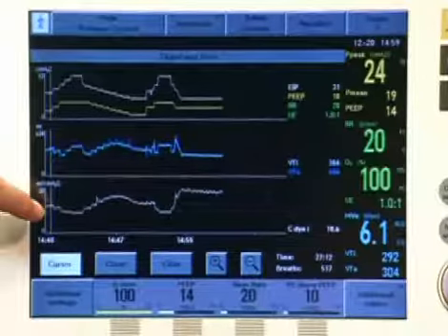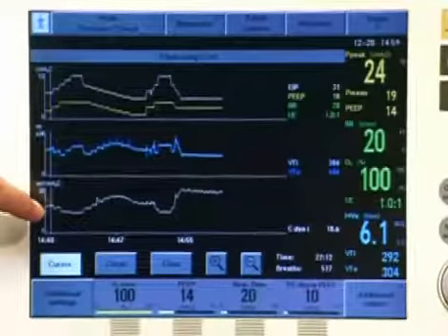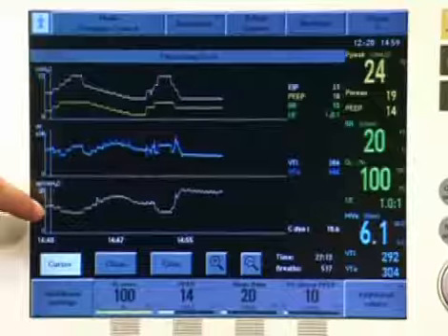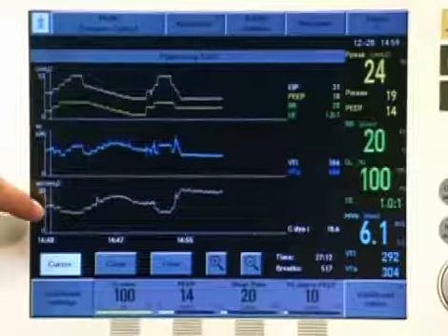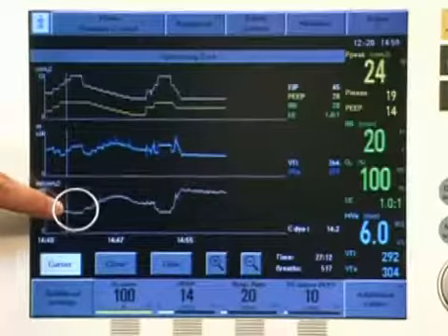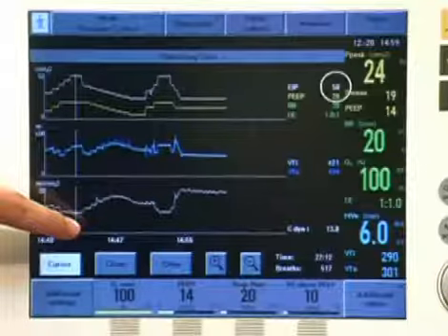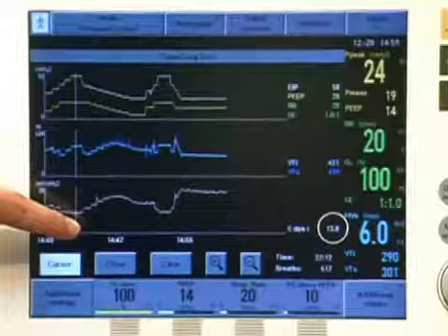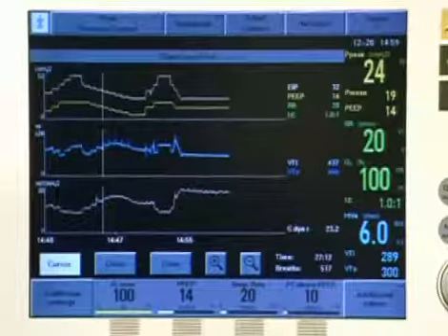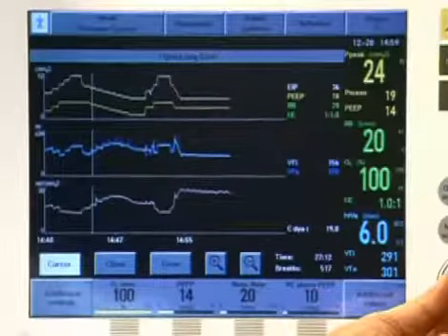The cursor leads us through the complete sequence, identifying the important phases with their corresponding settings. Baseline ventilation, plateau pressure of 30 centimeters of water, PEEP of 10 centimeters of water, dynamic compliance of 19 milliliters per centimeter of water. Stepwise increase in pressure, slow decrease in compliance. Long recruitment with inspiratory pressures of 50 centimeters of water. Compliance decreased to 14 milliliters per centimeter of water. Gain in compliance after removing the recruitment pressures back to pre-recruitment values. Progressive increase in compliance during the decremental PEEP steps.